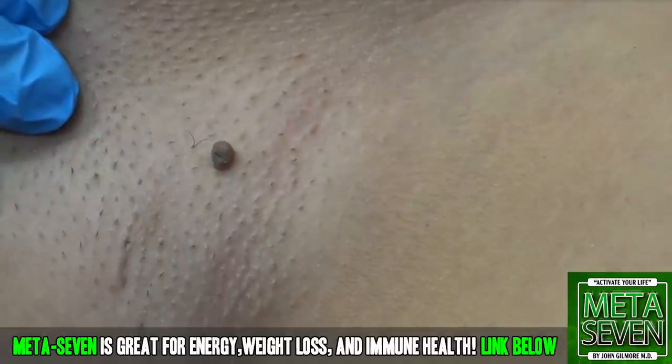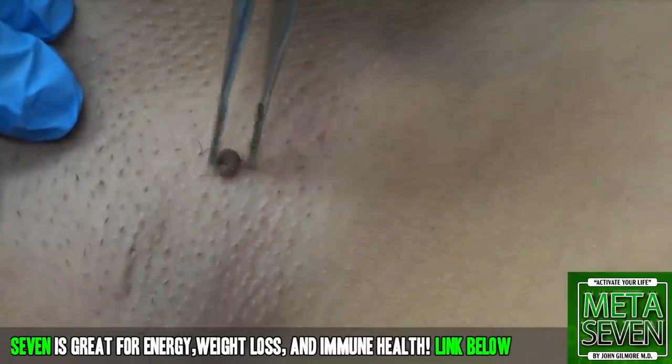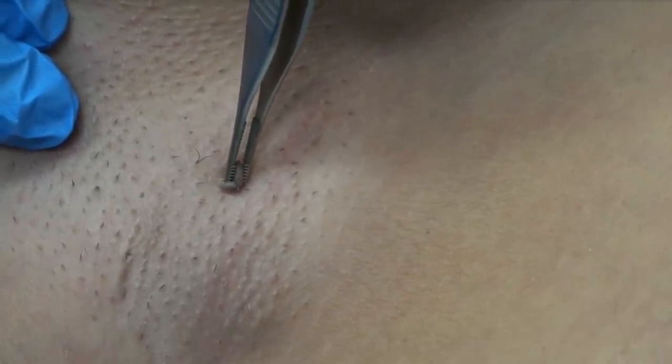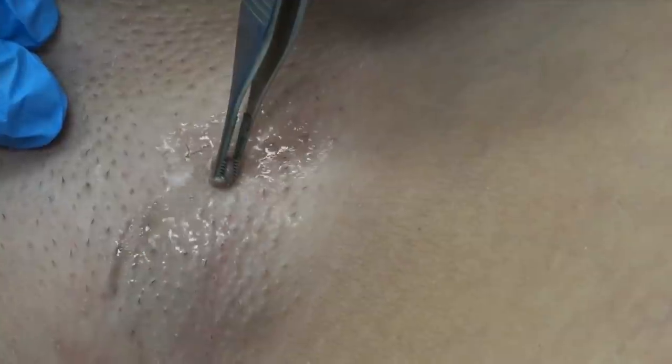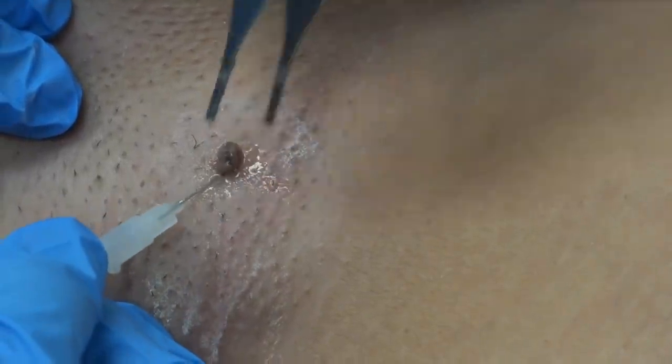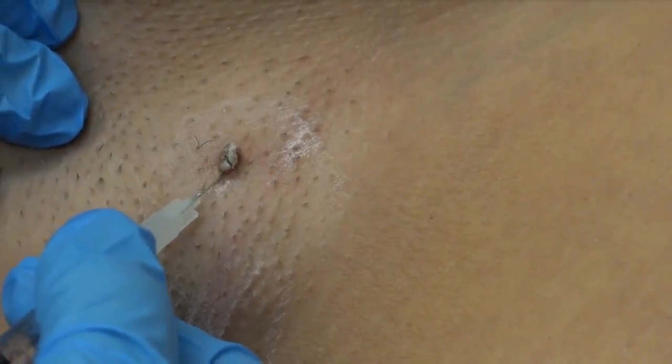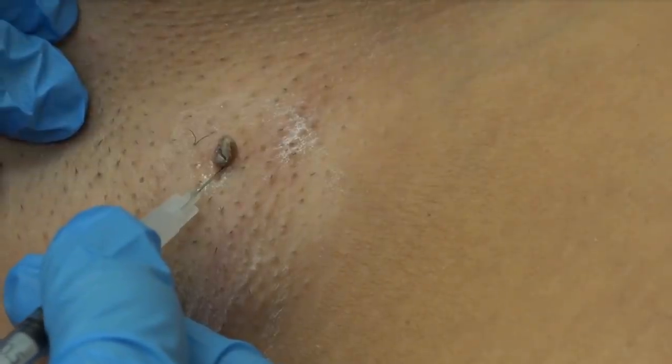Are we doing it on the mole or right under it? You're going to go at the stalk right underneath it - right between the skin tag and the skin. Pull up on it. Pretend it's like a tick and you'll be injecting the head of the tick. Ready for the cold spray? What size needle are you using doctor? I am using 27 and a half.